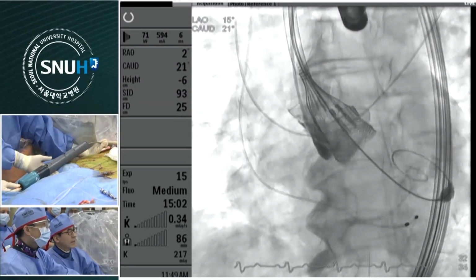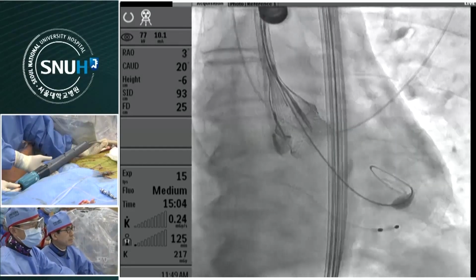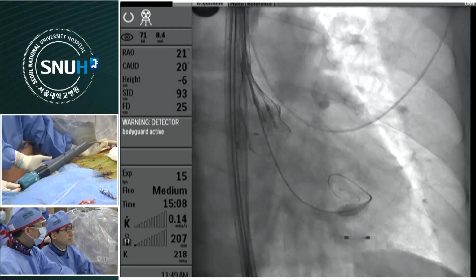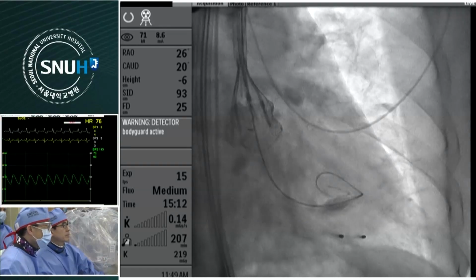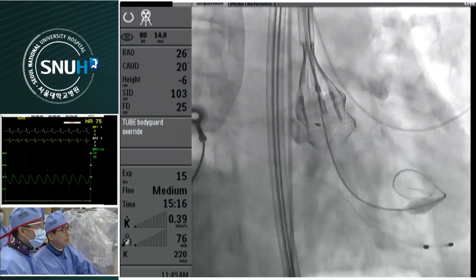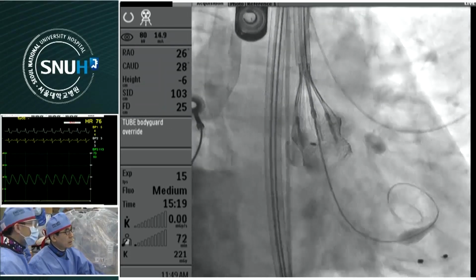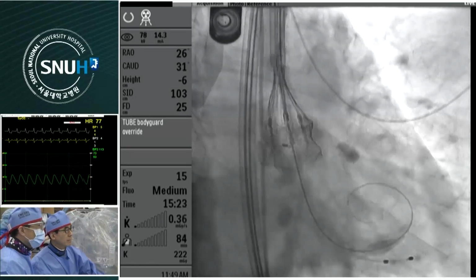It's better than the previous one in terms of depth. Right. You need to rotate it more. I think this status is acceptable. Don't try too high a deployment. Counter. Okay, good.